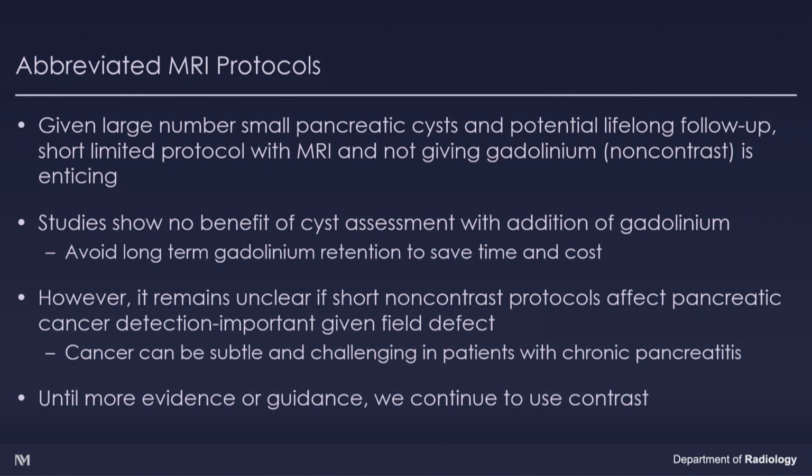The problem is, in my opinion, it remains unclear of how good we're going to be with these short non-contrast protocols in cancer detection, because some of these patients will have very heterogeneous pancreases, hard to assess, and cancer sometimes can be subtle and challenging in patients with chronic pancreatitis. So at this point, at least until there's more guidance, we continue to use contrast, but I certainly think it's potentially appropriate not to give contrast.